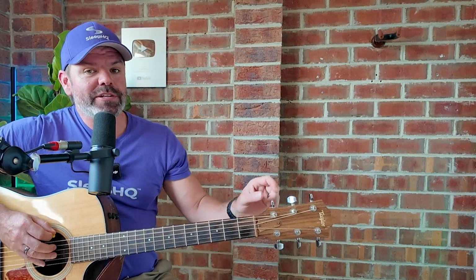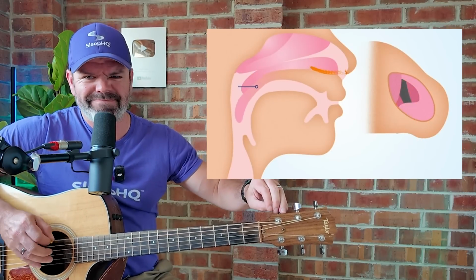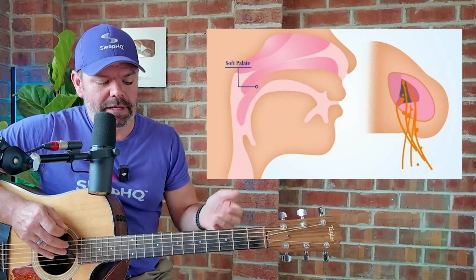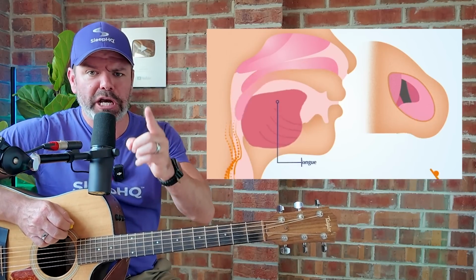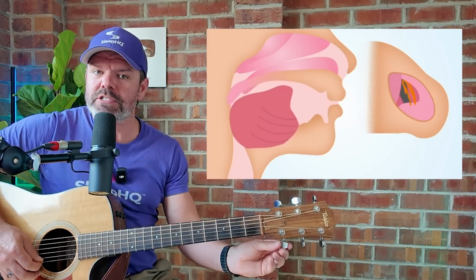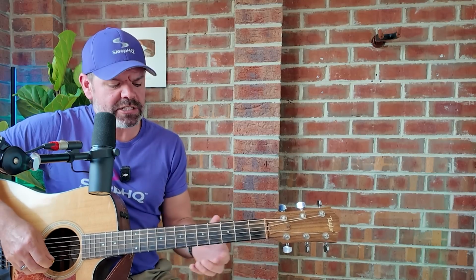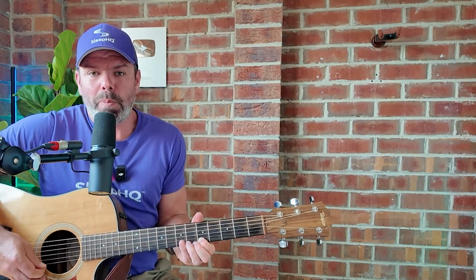You see, if one of the strings is loose, or the pressure low, it doesn't sound right, and the string is floppy, just like your airway. But vice versa, if the string is too tight, well, it could snap. It sounds harsh, it's difficult to play. Similar to when your CPAP pressure is too high. It can cause discomfort, side effects, make things uncomfortable.